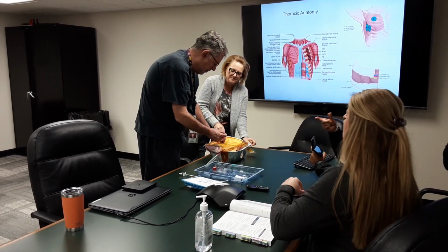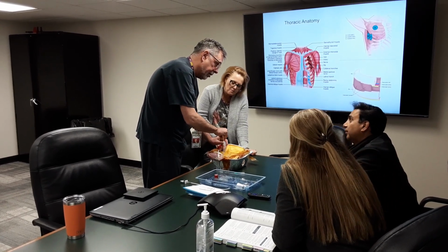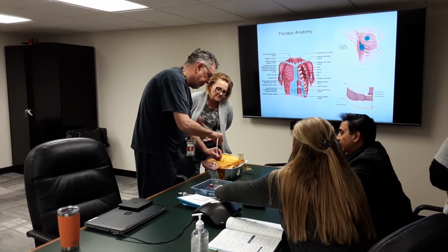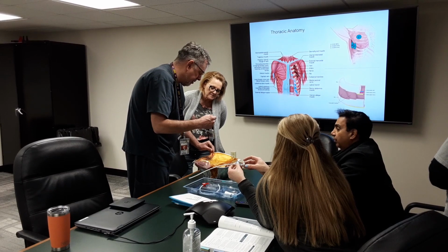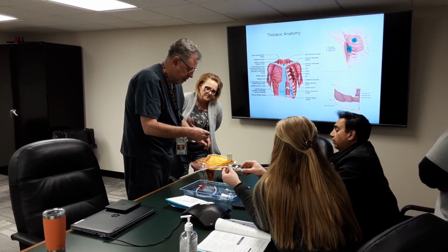While you're going in, you're just kind of injecting with lidocaine then too? I would be in that case until I got down where I was in, then I would stop doing it, and then it's kind of retracting. Yeah, so now I'm introducing the wire, and it's passing easily. I'm gonna get the wire, and I'm gonna take the needle off.